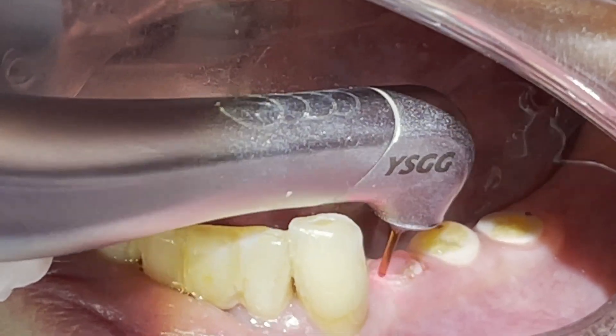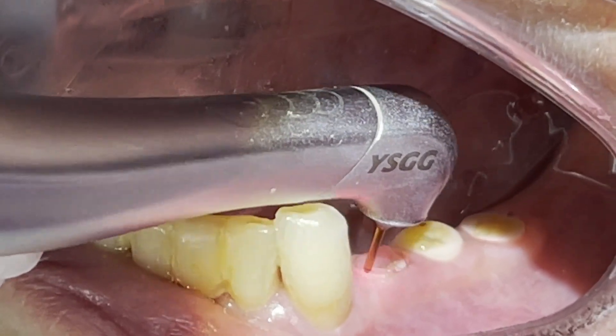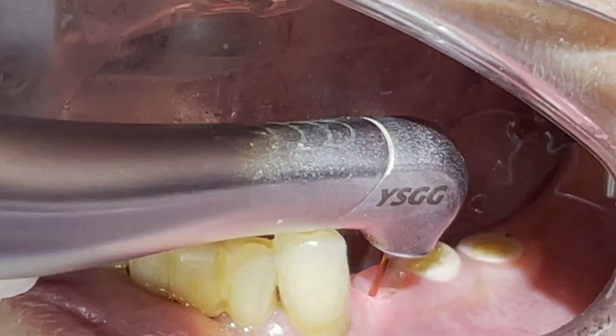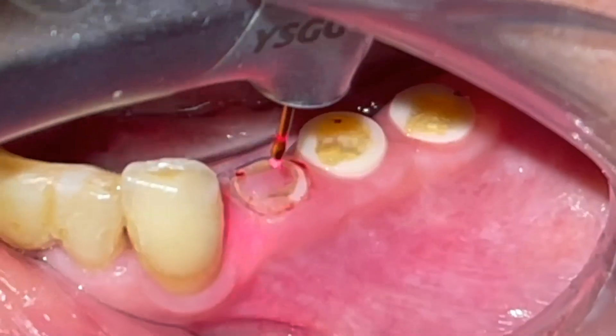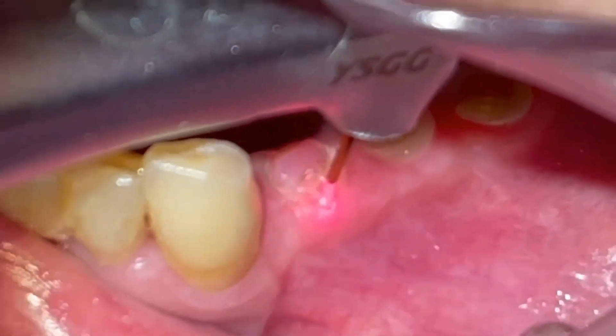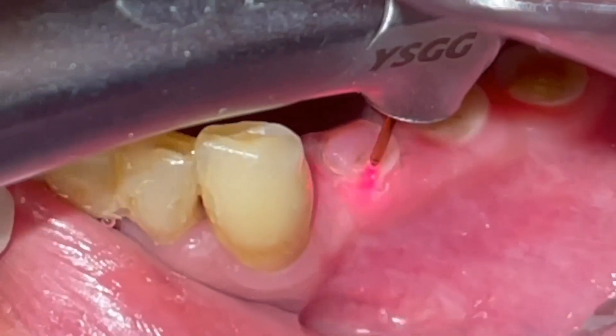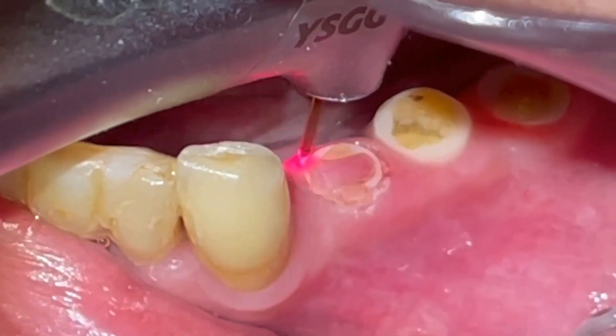Four months later, the Waterlase I-Plus is used to expose the margins of the implant. Then the abutments are chosen and cemented just like on the other side, and all three crowns are created with the CEREC.